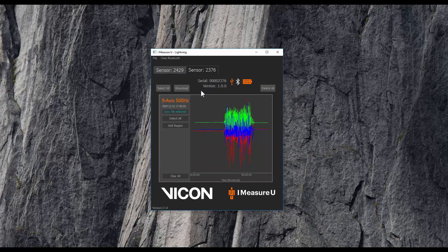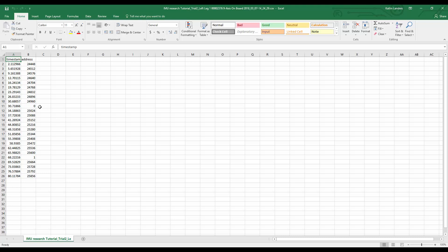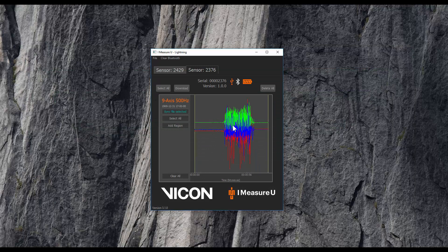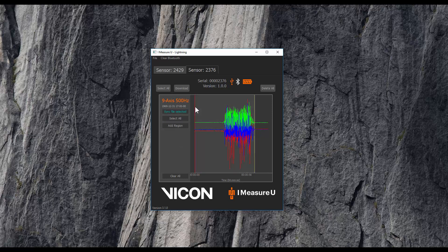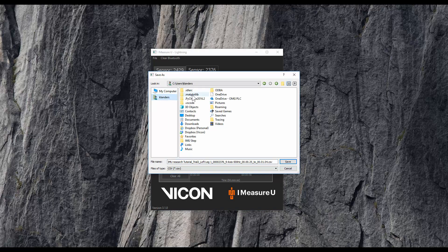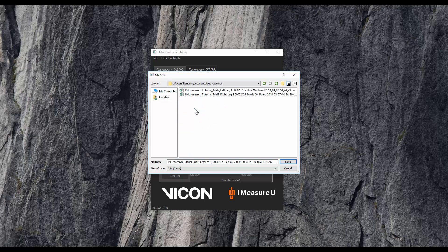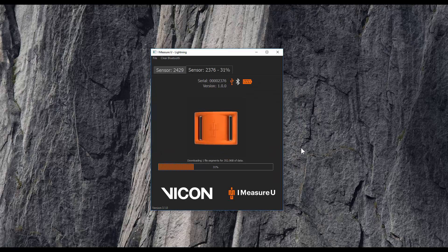Next, I need to select a region to download. I can either choose to select all and download the entire trial, then use the sync file to extract the region of interest chosen during collection — where 0 is the beginning and 1 is the end of that region of interest — and then use the timestamps to extract only that region from the downloaded trial. Alternatively, if I clear all, I can add a region and then manipulate its bounds manually. Once the region has been set, I can click Download, specify the download location, give it a custom file name of left leg, click Save, and then wait for it to download.